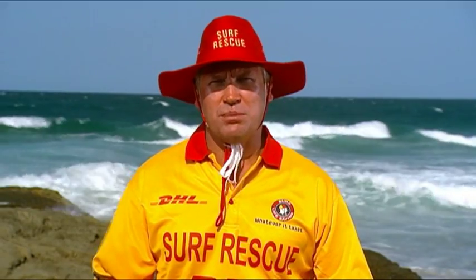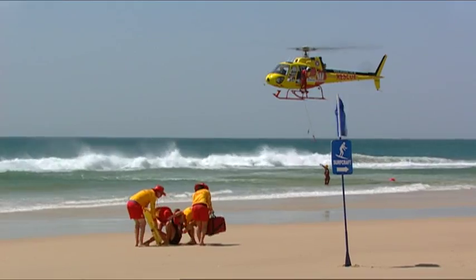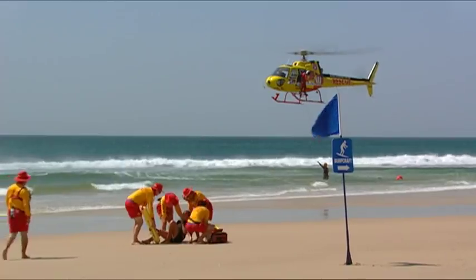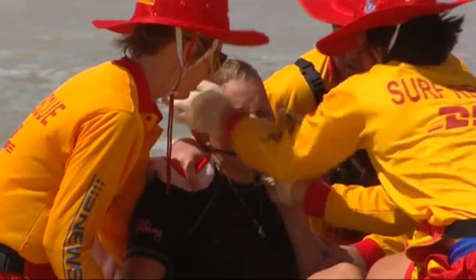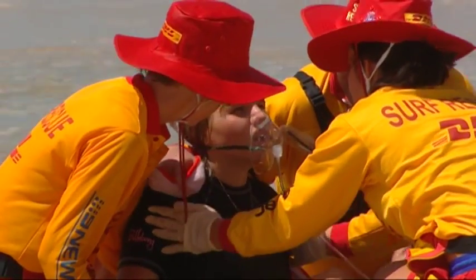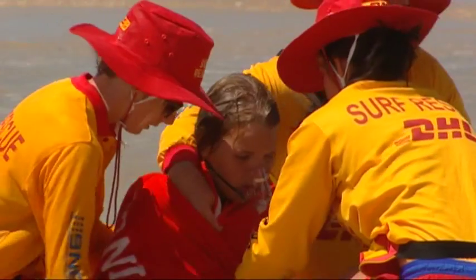Oxygen resuscitation provides the patient with up to 95% of oxygen and is delivered through a resuscitation mask. It helps build up the necessary oxygen levels for a patient. All oxygen cylinders have a white top or shoulder. When delivering from a full C cylinder, 440 litres, the following amount of oxygen will be delivered.